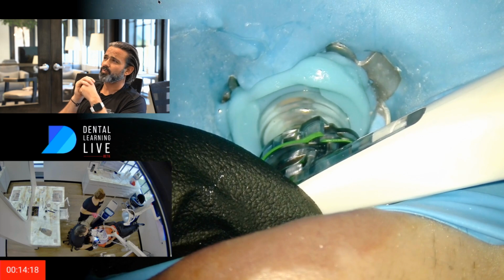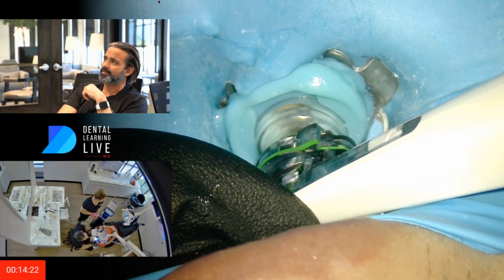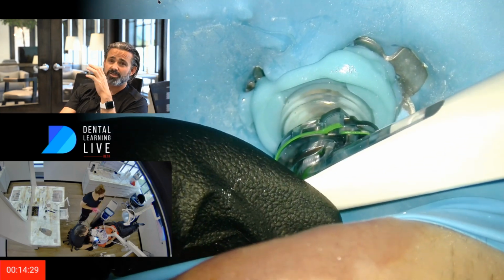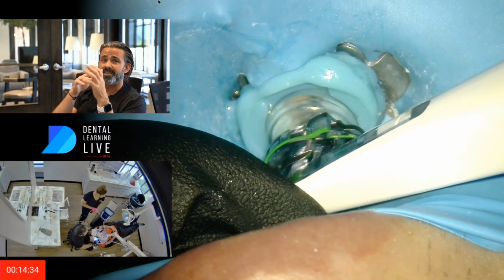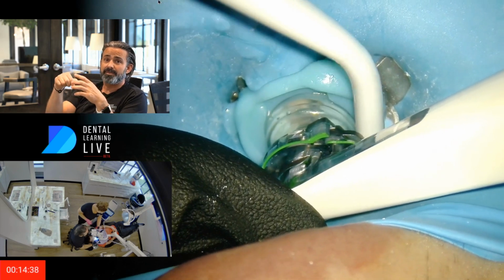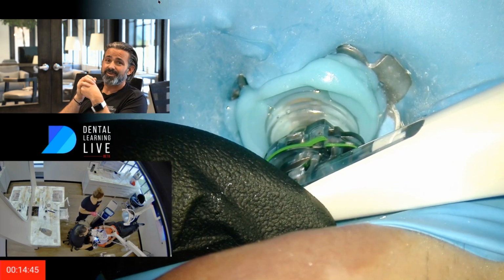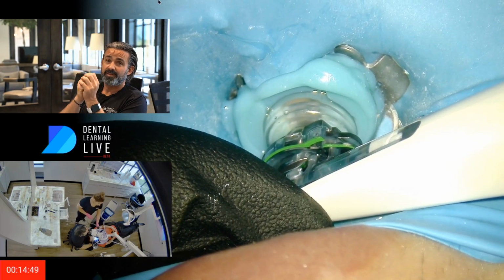Now, if you look really close at what's going on in here, you're going to start to see a pink cloud in the window of that sealing cap that's touching the sound seal. It looks like a pink cloud, and sometimes it will puff pink. What that's doing is this mechanism: as the degas fluid comes down and creates the cavitation cloud, it's generating negative pressure. And it's also generating sound. As those bubbles expand and collapse, there's a sound wave that's created.